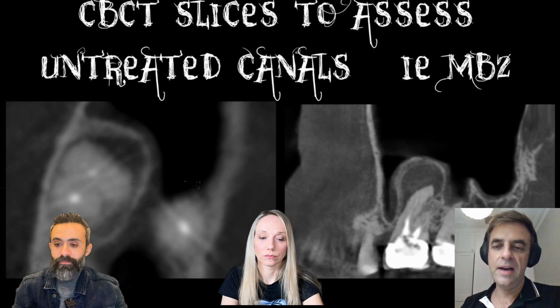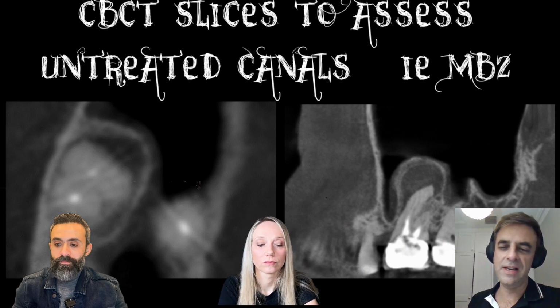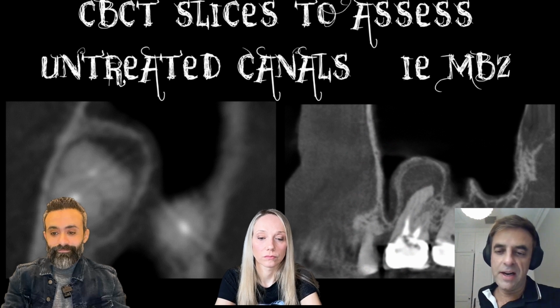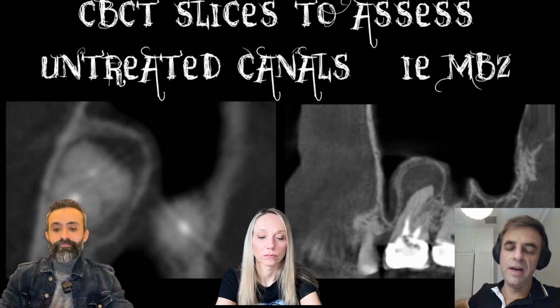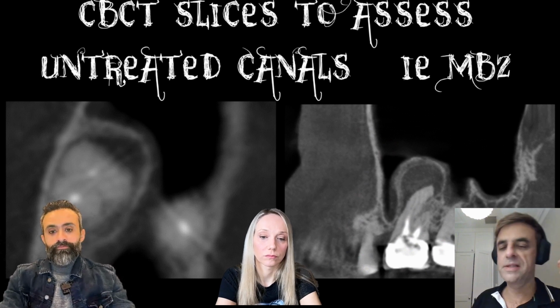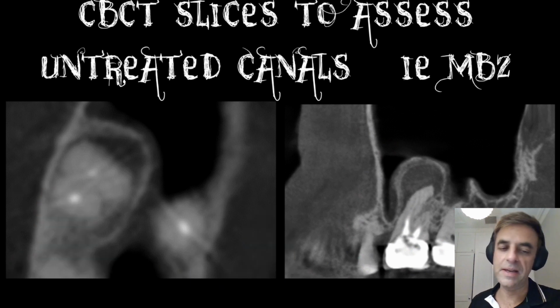So we look at basically the asymmetry, and you can see here there's a slight asymmetry, although it's an upper 7 in a first molar position, this tooth. So you won't see another canal, but you'll see that there is some asymmetry to this, but it'll probably just join up, as you can see in the slice there. It's not buccally placed. And if it was more buccal, you would say there was a separate MB2 more palatal, but it looks like it's going to be one of those figure 8 shaped MB2s, which is what it ended up being.